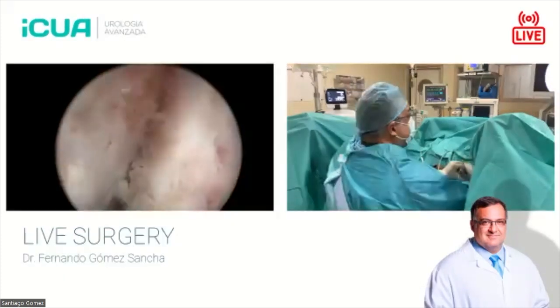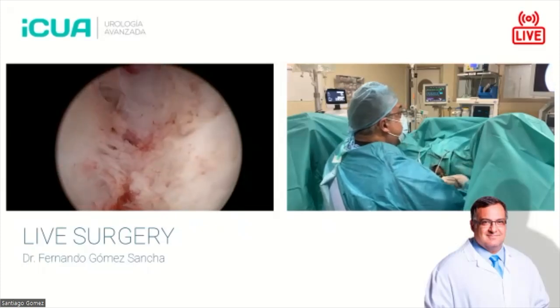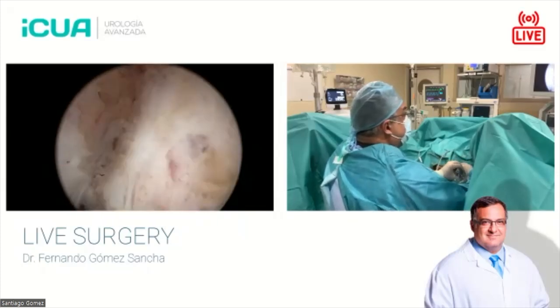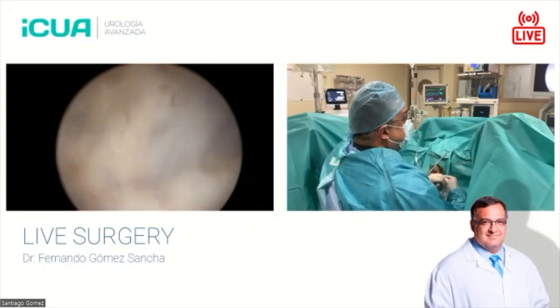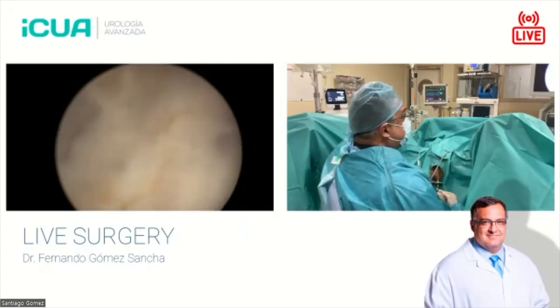And then I will continue my dissection, but looking at the proper plane. You see here? And why don't I go further up, deeper in my dissection? Because there is some apical tissue still here. If I try to go up, I will tear, I will break this fiber. So I'd rather cut them first, you see? If you cut the apical fibers first, then you can continue dissecting the plane.